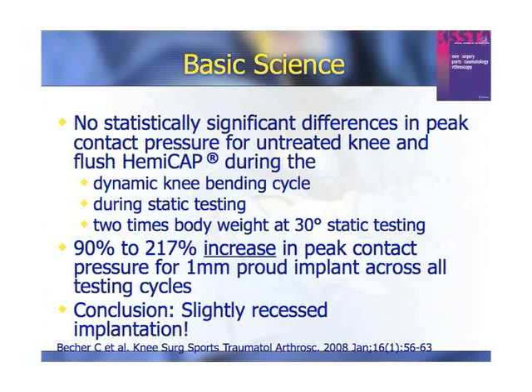What I take home from it as a clinician is that if you're seeing cartilage grow in, you're offloading the perimeter, which, as we know, when we have lesions at a critical size, 20 millimeters in circumference, is when edge loading occurs, and that's when these lesions propagate. I don't have an explanation as to why this happens. Perhaps Dr. Miniacci or Dr. Uribe may be able to better explain that phenomenon. The take-home message clinically is that when I see that, I feel that what we're observing, in a dynamic fashion, and I'll have some more data to discuss this, is that perhaps we're stopping this propagation, which is an all too important step in the progression of osteoarthritis.